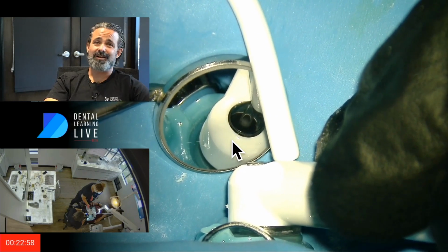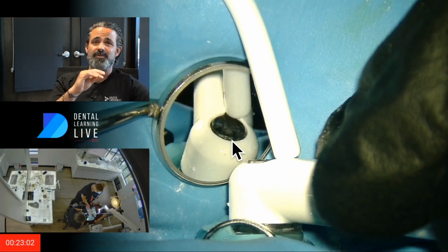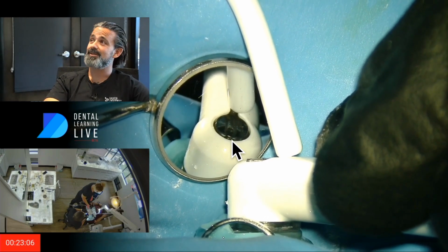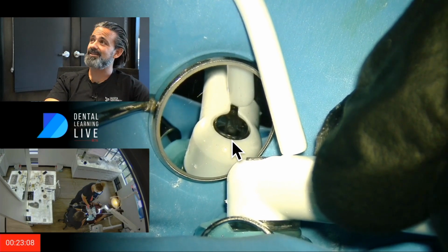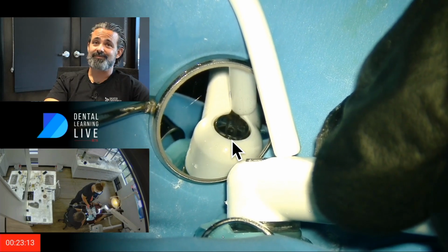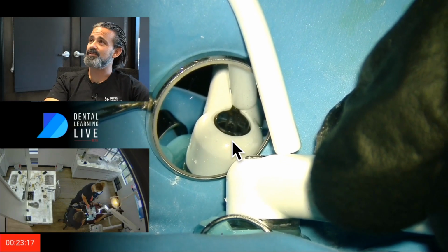You know, honestly, most often I find with this there is a little bit of a hum, a little bit of a sound that goes on. And I really do fall asleep. Unless they're watching my TV in the ceiling or laughing at something on TV, they're really just mesmerized by it. It's like white noise, kind of puts them to sleep. It's kind of soothing.